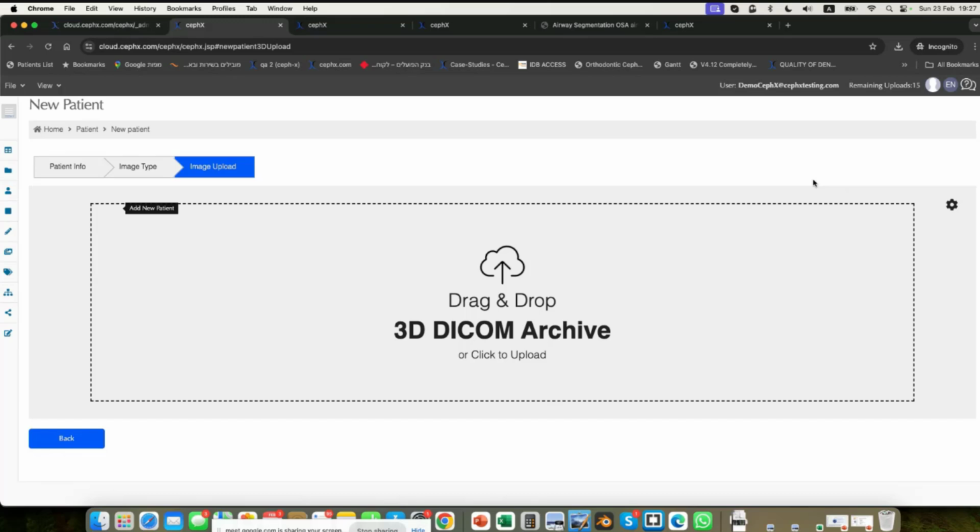And it would be the same for the scanner, yes? If we choose a 3D, is the scanner compatible with iTero? Well, all you need to do is export it to an STL file from the iTero. And then, yes, you can upload any STL file. Okay, thank you. Any other questions?